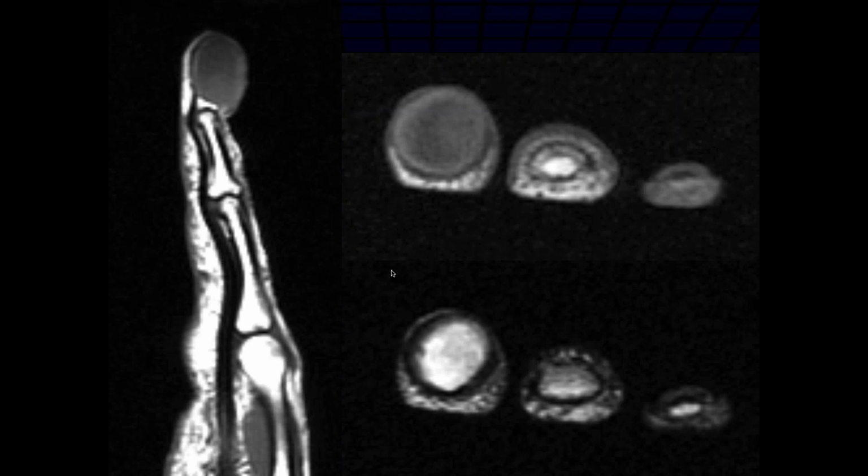Okay, so T1 image in the sagittal plane and axial plane, and a T2 image in an axial plane. So there's evidence of a very well-defined oval lesion involving the distal phalanx. I can't see the bone very well in the axial images. It's kind of completely eroded. So I would be concerned for either a glomus tumor or an epidermal inclusion cyst, perhaps.